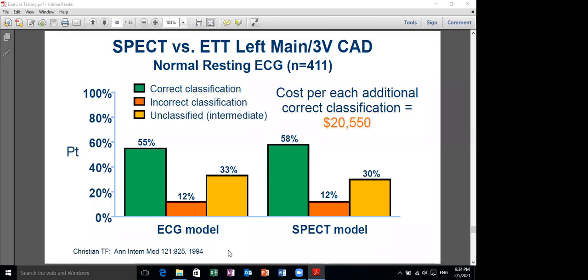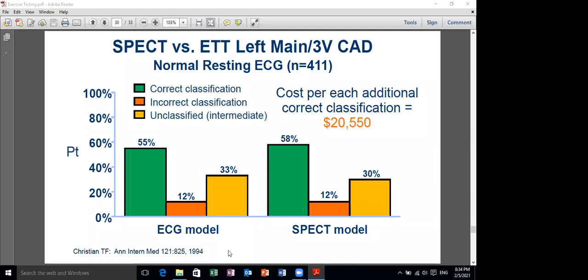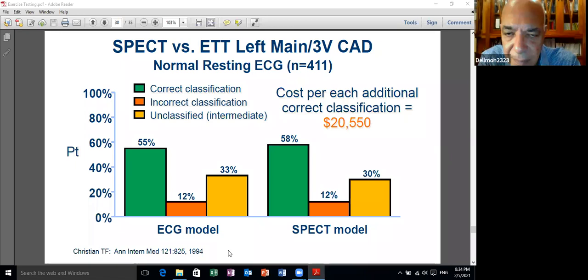في سؤال بيسأل عن downgrading of exercise ECG in the new guidelines. دكتور محمد. هو احنا داون جريد اكسرسايز.